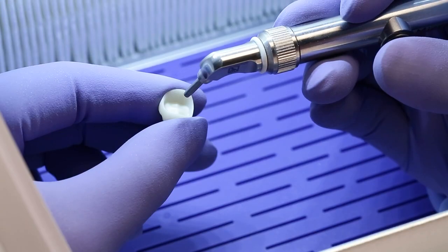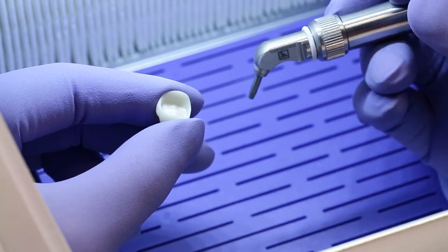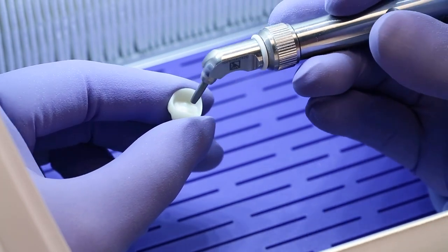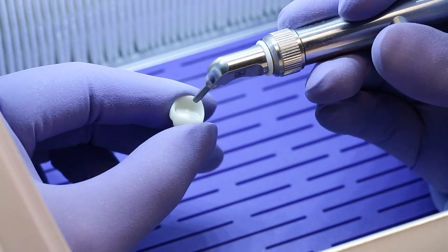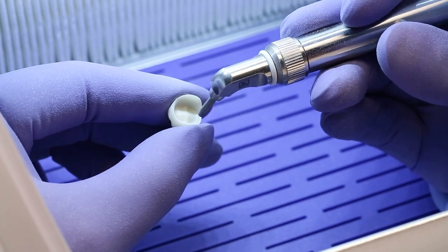To prepare the zirconia crown for cementation, sandblast using a micro-etcher with 50 micron aluminum oxide. Hold the micro-etcher nozzle approximately 5 millimeters from the intaglio surface and etch using a slow, even motion until the entire surface is etched.